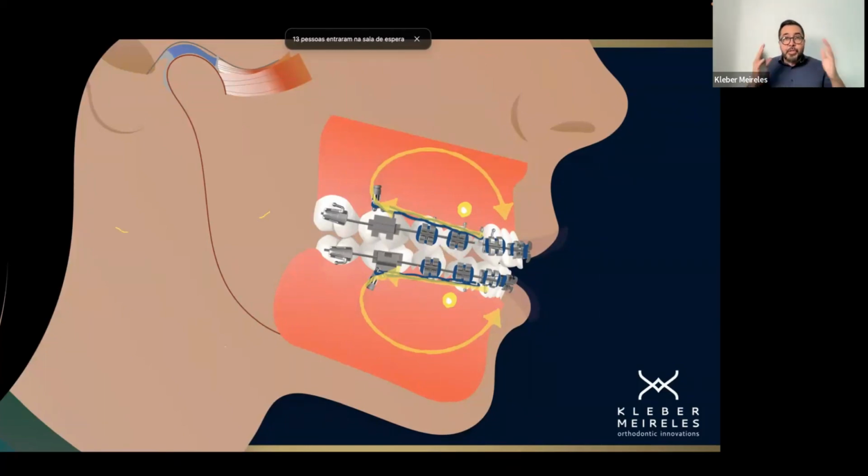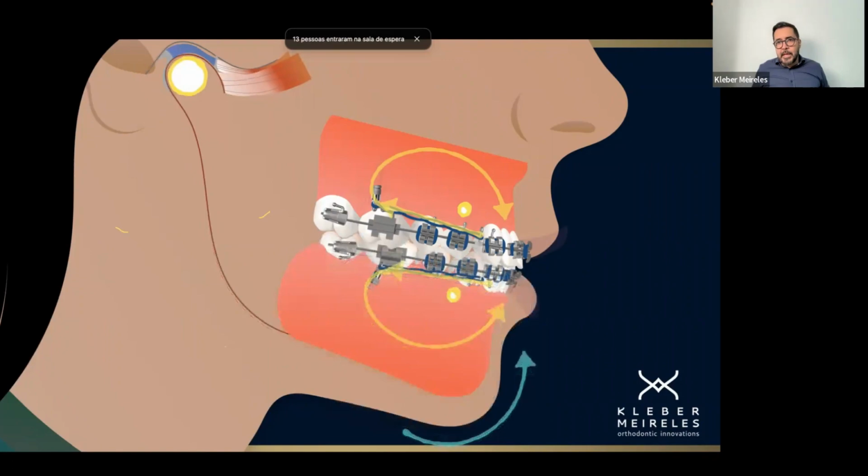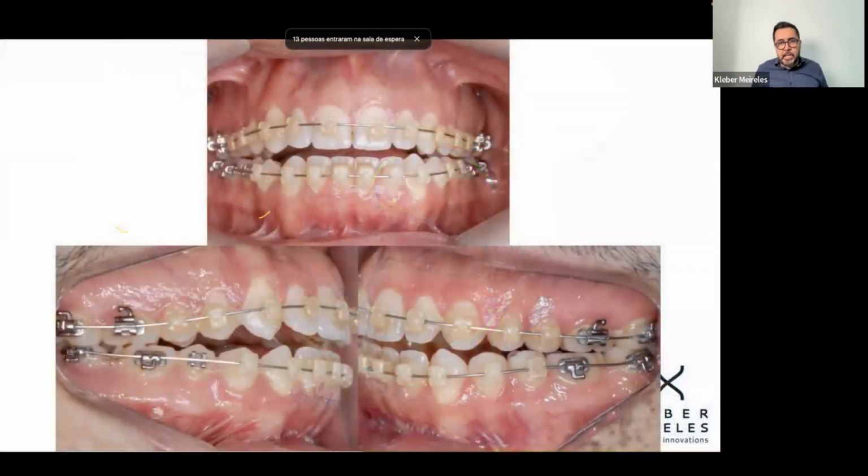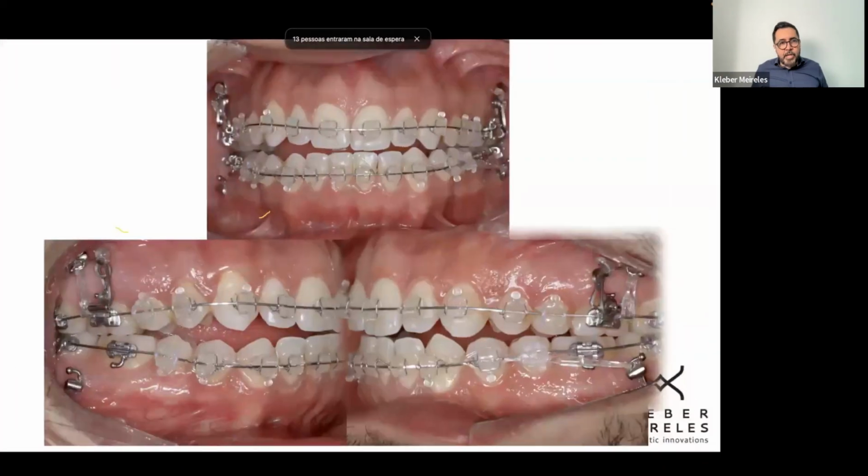So you understand now that we need to see everything in orthodontics, previous to the biomechanics, of course, the diagnosis, because from the diagnosis, I'm establishing what I want. So here it is, and the intrusive force applied here allowed for the counterclockwise rotation of the mandible. And here is the case, and what I'm applying here is distal force both in upper and lower arches.